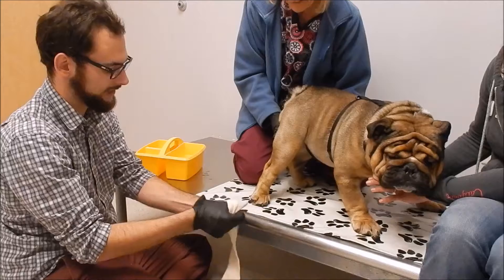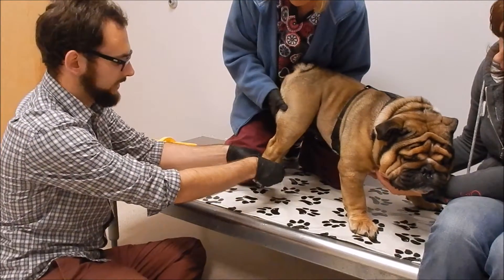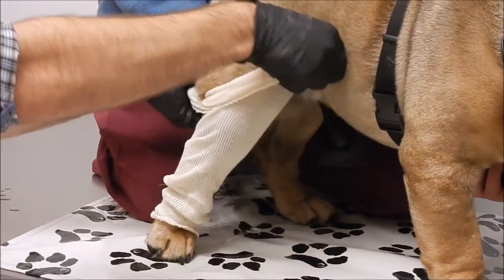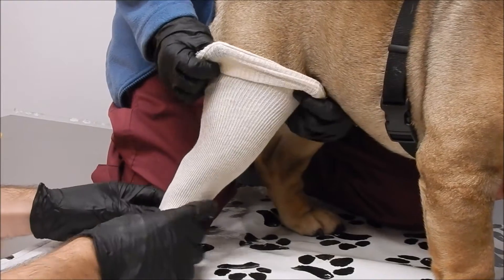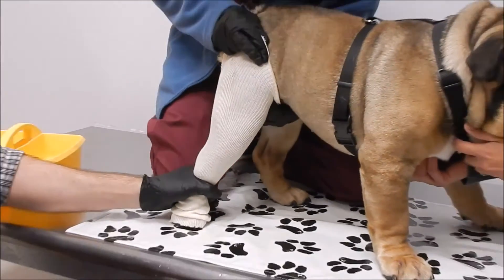Our first step is we need to put a stocking on his leg. We put it in a little water. Terry lifts up the leg gently, and we're going to work our stocking net up. For Bulldogs, we have a special suspension sleeve that we want to have above and below the hock. So I have this stocking net extra long so I can start my cast where my hand is now.